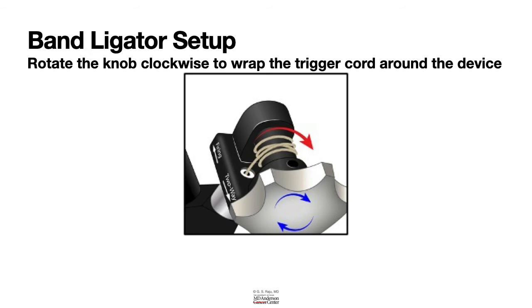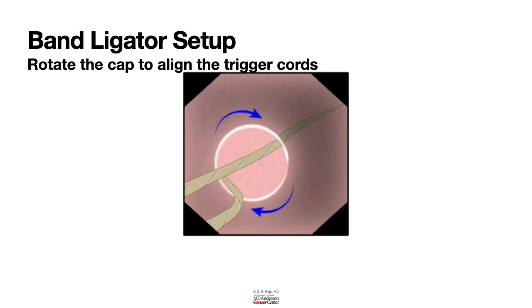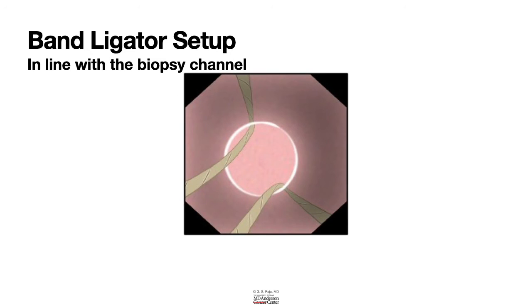Once you've done this, make sure you attach the band ligator cap to the distal tip of the endoscope and push it all the way back. And when you look at it, if it is not set properly, you can rotate the cap to align the trigger cords in line with the biopsy channel so that you have a clear view. So this is all it takes to set up a band ligator.